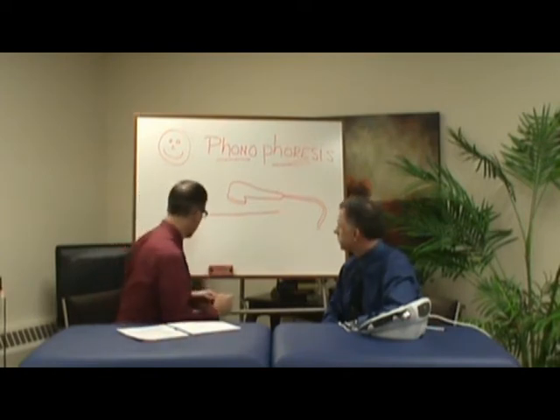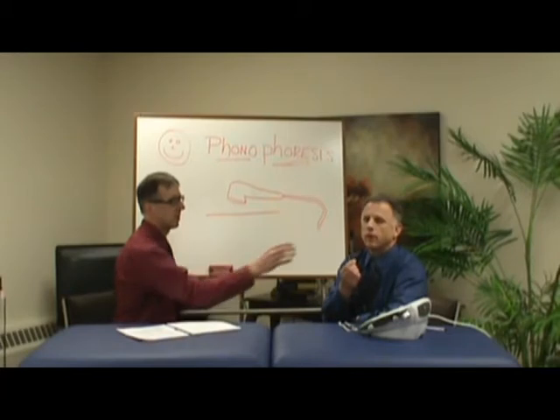So again, what we got here is, do you got the black marker? Yes, I've got it right here.